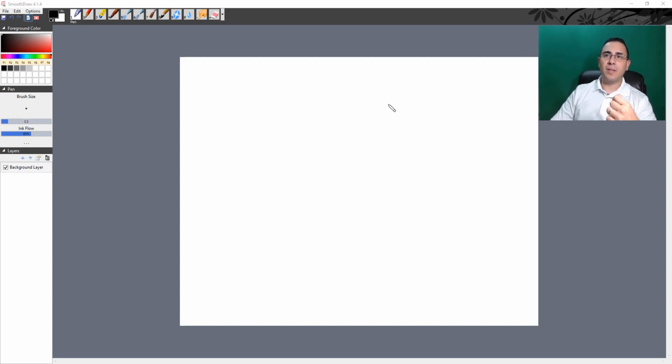So aliasing is a bad artifact because it will position the peak systolic velocities in a place where they don't give you any information. But sometimes aliasing is not bad at all because it tells you that there is a high velocity in an area where you need to know that there is a high velocity. Let me explain this a little bit better. When you're looking for stenosis, in the area of stenosis, based on the hemodynamics knowledge that you already have, the velocity is high. And then when you place your color box and you do your color Doppler analysis, then you see this aliasing that tells you, hey, there's high velocity.